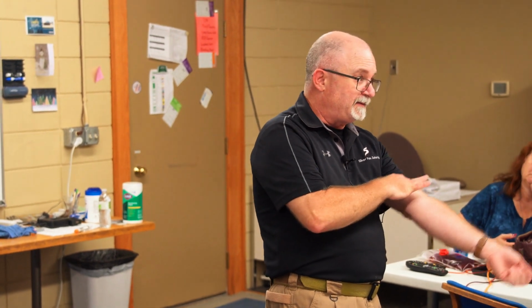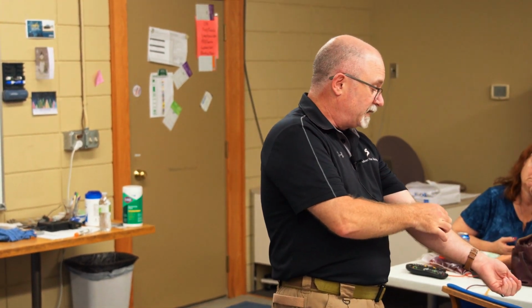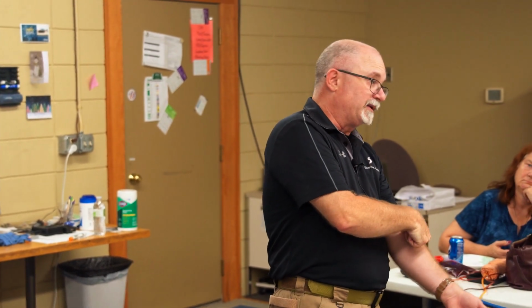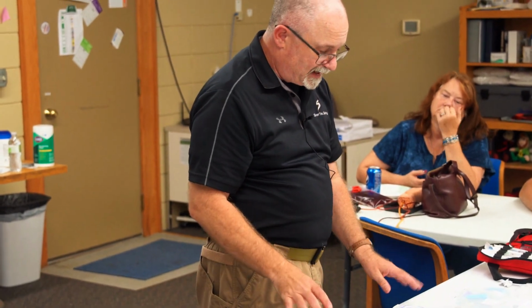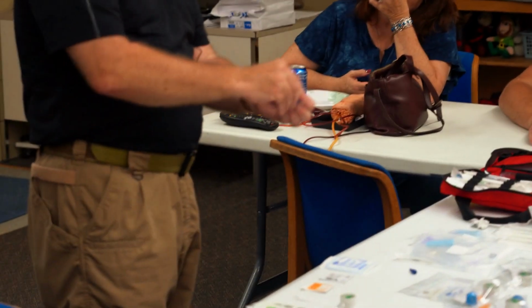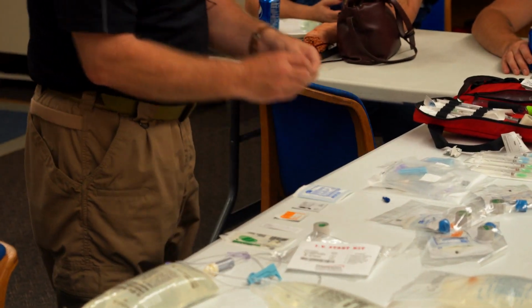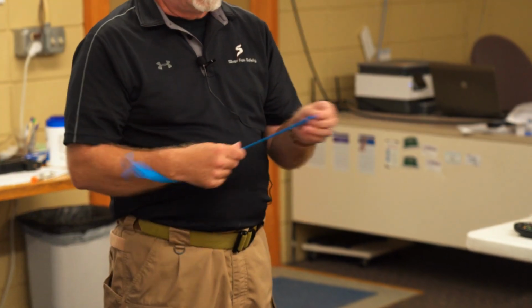Okay, and then a 2x2, which can be handy if you don't tamponade when we're starting it. You get a little bit of leakage, clean it up, or if we miss and we want to put an easy bandage on, you've got a 2x2 ready to go. So before I get started, and then the tourniquet. These are not so bad.